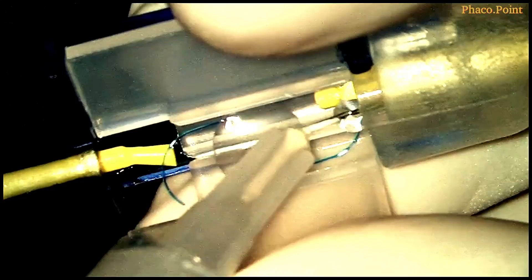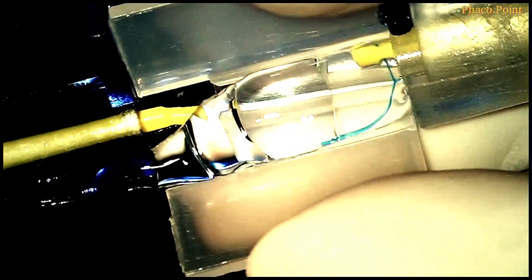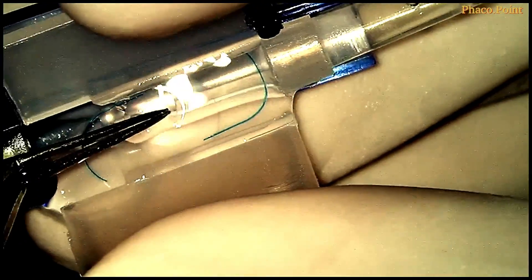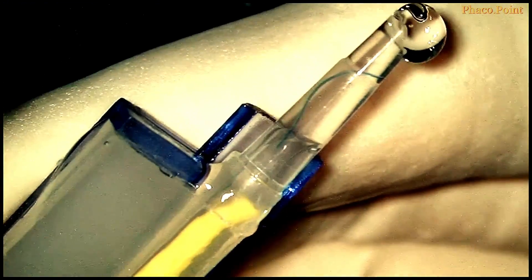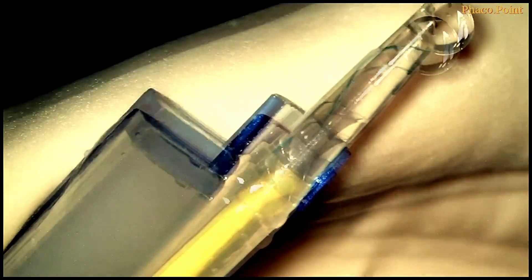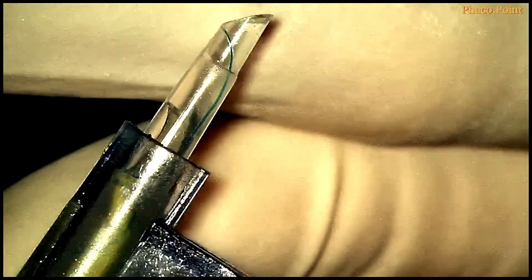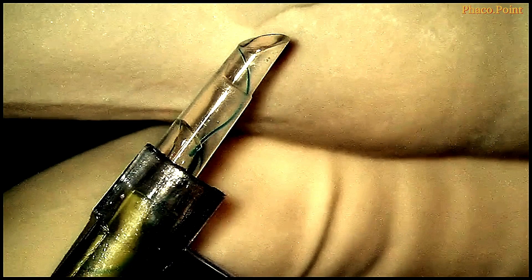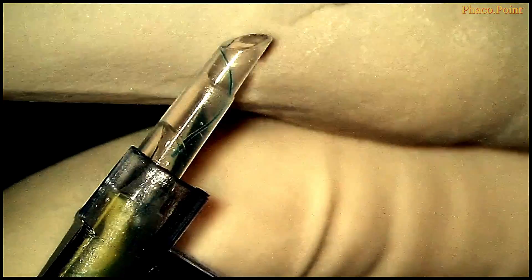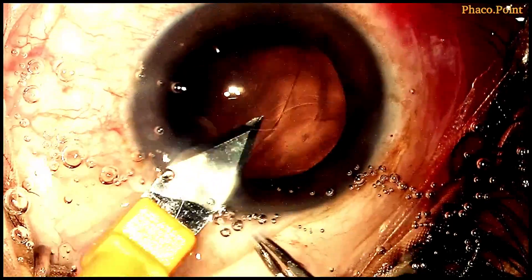Let's move to implantation of the three-piece IOL in the sulcus. It's extremely important to load the IOL under the microscope and clearly see, as you inject it to the tip of the nozzle, what is the orientation of the leading haptic — because that orientation tells you how you need to rotate the nozzle whilst within the eye.